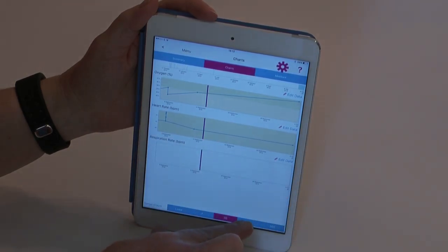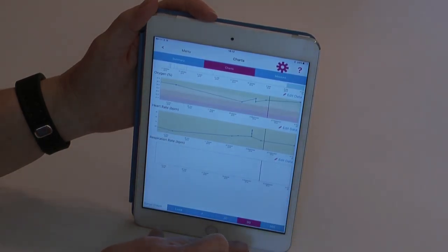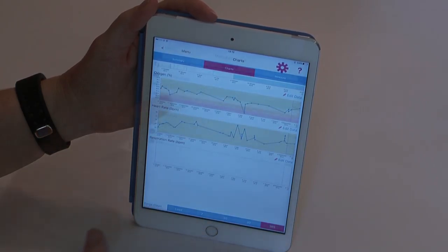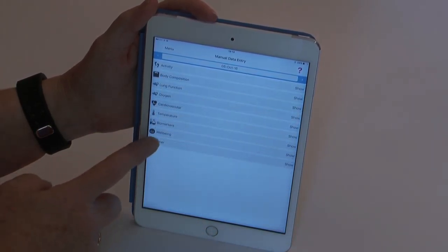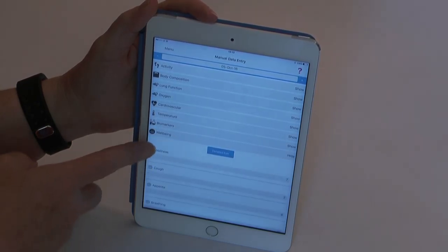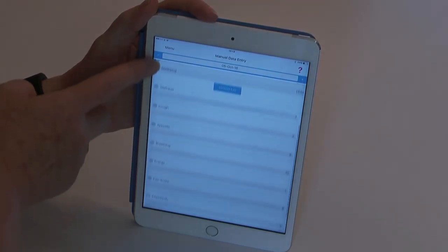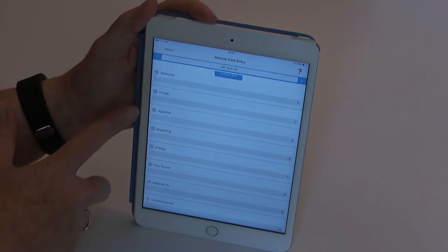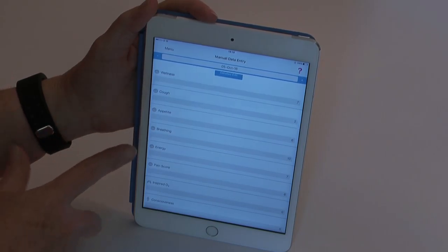By looking at these charts over time you can see periods of declined health and improvement, and these can be shown and shared with your healthcare team. You can also add manual entries into your account, and these can include things like severity of cough, your well-being, and your energy levels.